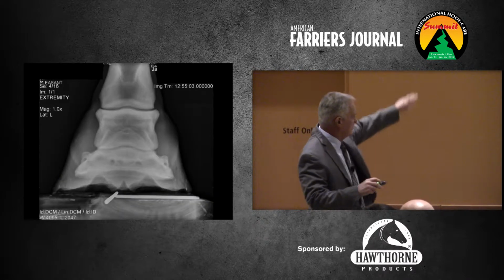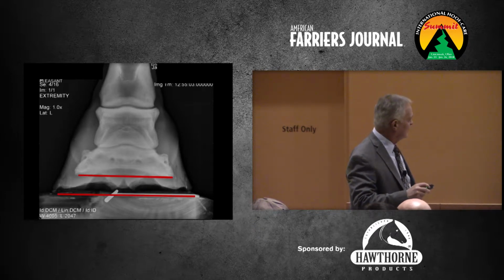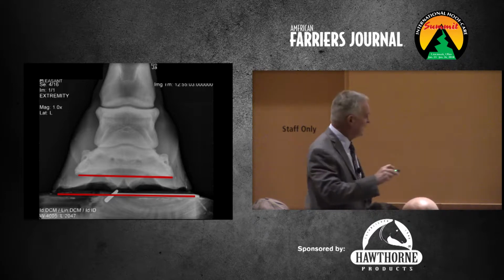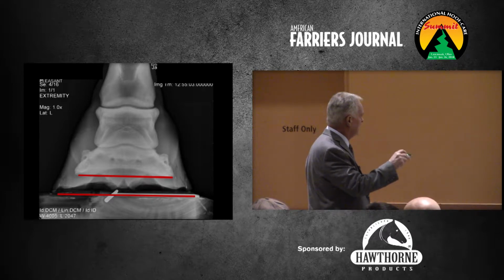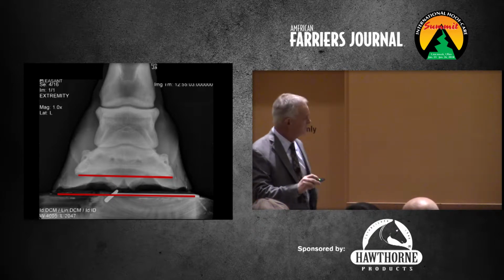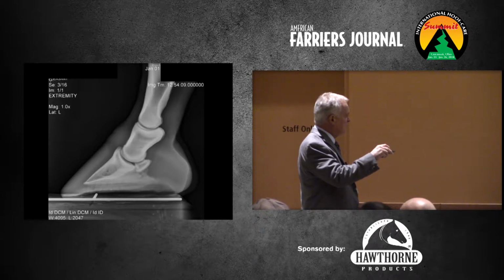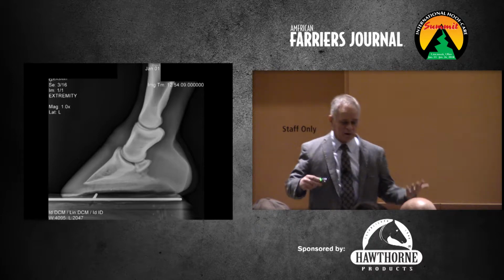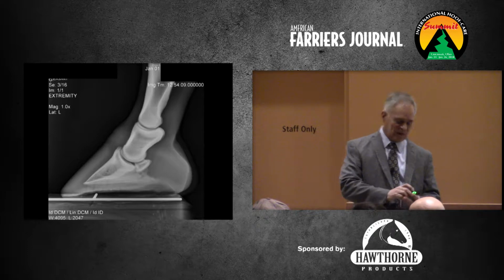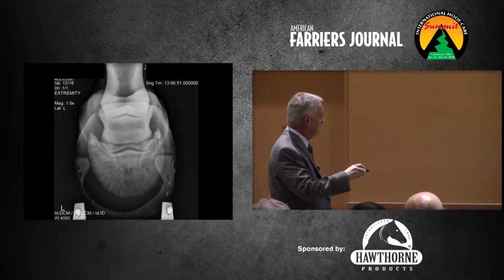Okay, here's your podiatry view, your DP. You can draw your lines, and you could argue maybe he's slightly high on the lateral side, or maybe he's flat. We know the markers, this is the outside of the foot. But nothing horrible. Now again, what we've done is we've stepped up and shot up here. And so this is where I'm going to say his navicular bone's a little misshapen. This is where the vet's going to hedge. This is that 65-degree DP.